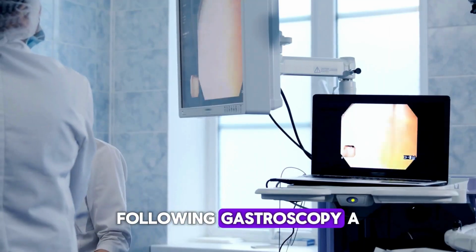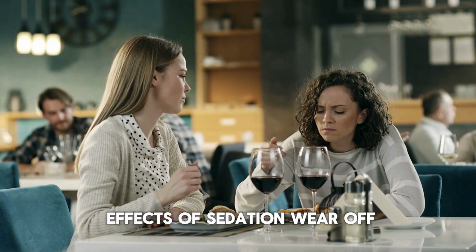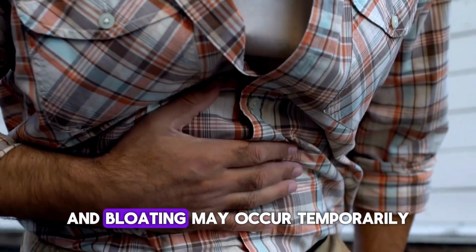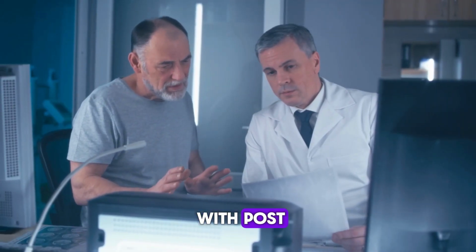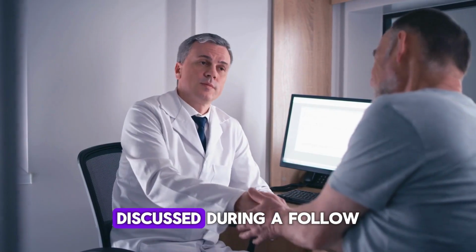Following gastroscopy, patients are typically advised to refrain from eating or drinking until the effects of sedation wear off to prevent the risk of aspiration. Mild throat discomfort and bloating may occur temporarily but generally resolve within a few hours. Patients are usually provided with post-procedural instructions, and any pertinent findings or recommendations are discussed during a follow-up appointment.